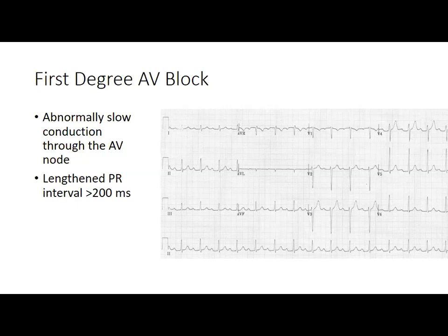In a patient who's asymptomatic with this, it makes you worry that they have some conduction disease, because they probably do, but it's not bad enough yet to do anything about unless they are symptomatic. It is really hard to prove that someone is symptomatic enough to get a pacemaker for first degree AV block. For the most part, first degree AV block results in EKGs that look like this with a perfectly normal rate. It's more of an incidental finding.